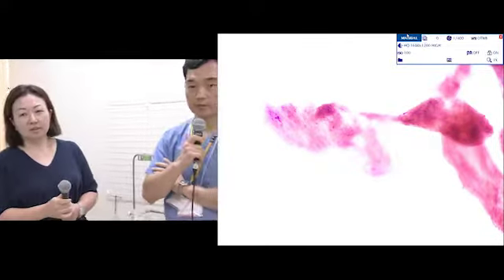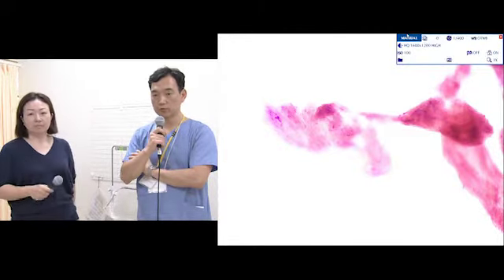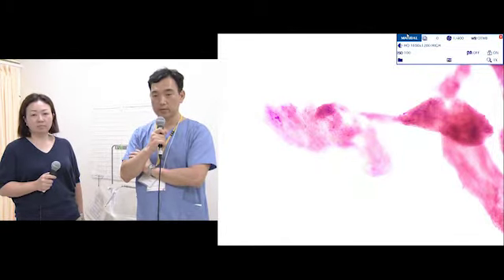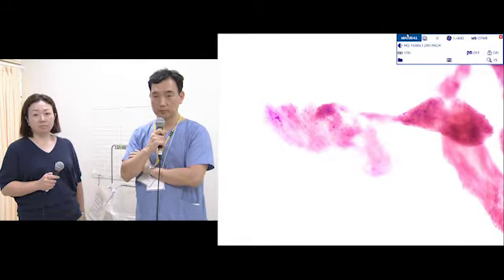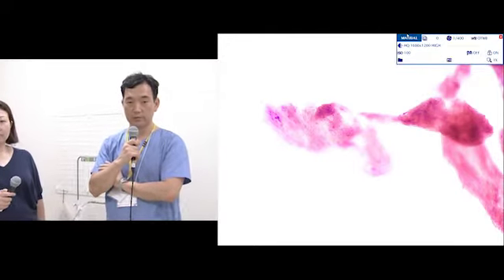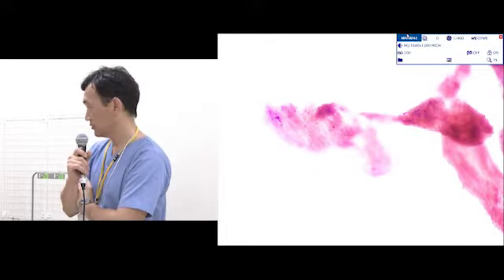So it's mostly connective tissue with a very uniform nucleus. It's more of an oblong type of nucleus, and there's no atypia. So according to Dr. Hirota, it's most likely a benign stromal tumor. It could still be a GIST, so the final pathology diagnosis will be made with the immunohistochemical stain. So the adequacy of the tissue is good, right?